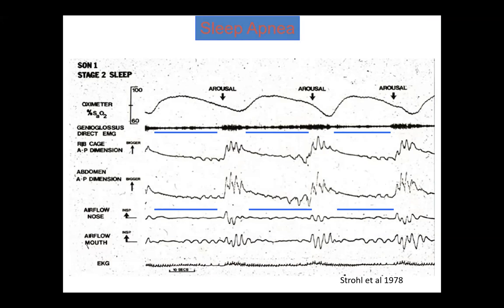Inwards? Well, it's equal and opposite, really. It's an obstructed apnea. There's no airflow there. So that's a completely obstructive apnea. The first one has a central component and an obstructive component.